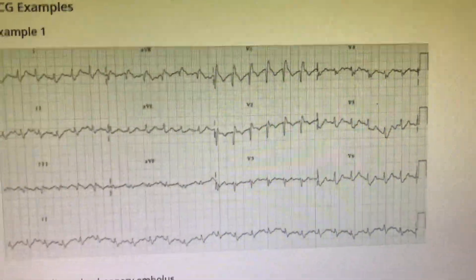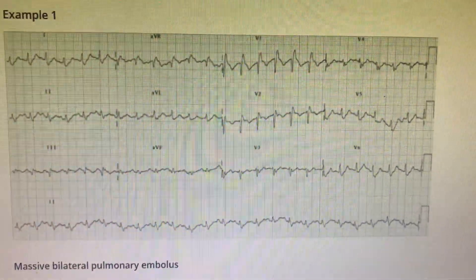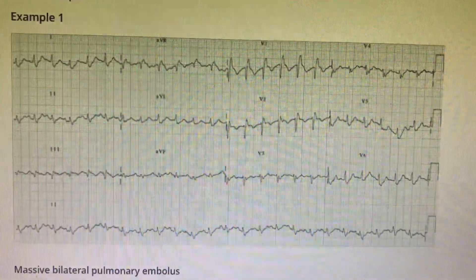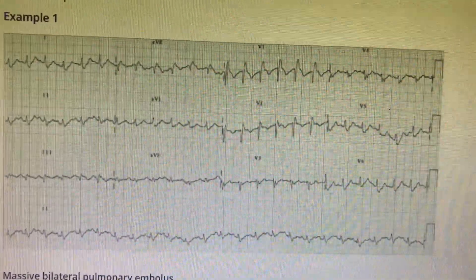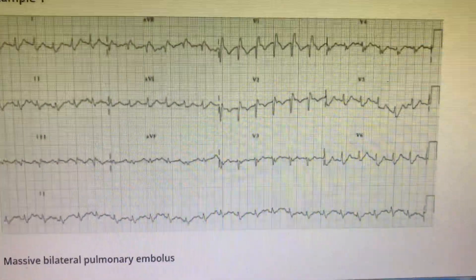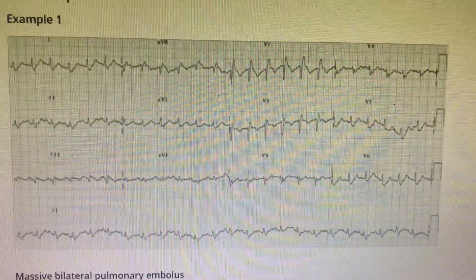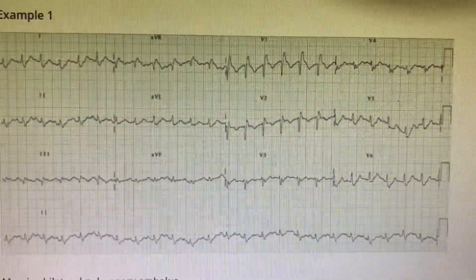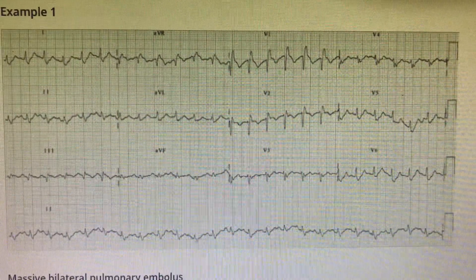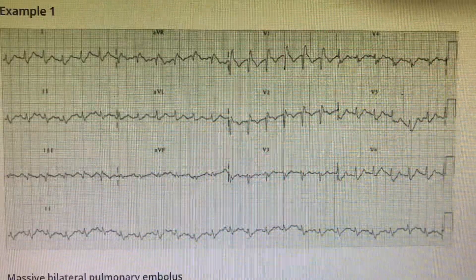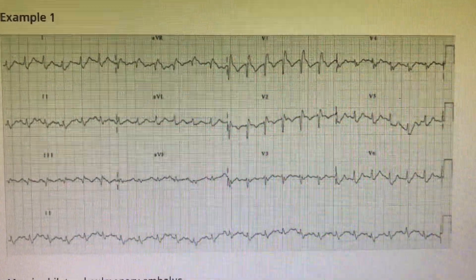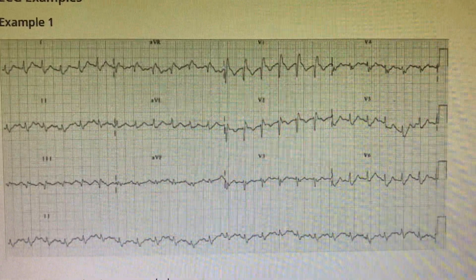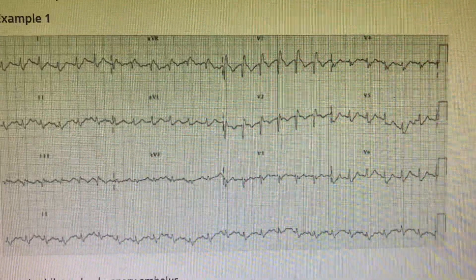The first differential diagnosis we are going to consider is massive pulmonary embolism. How will you identify it? There is tachycardia, and the patient is having deep Q waves. If you consider it, there is a small R, and it is actually an RSR pattern with a strain pattern.